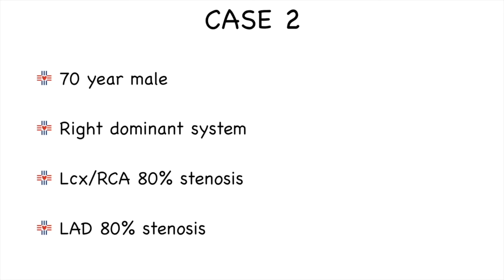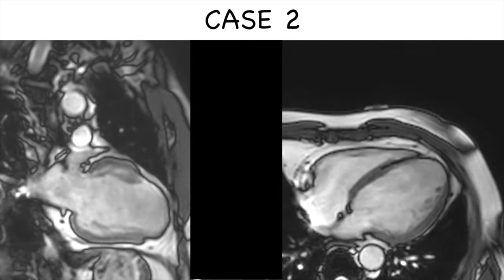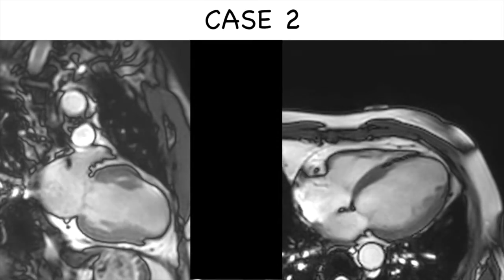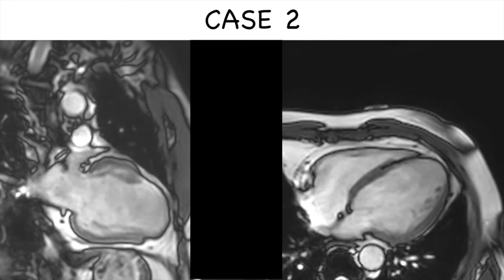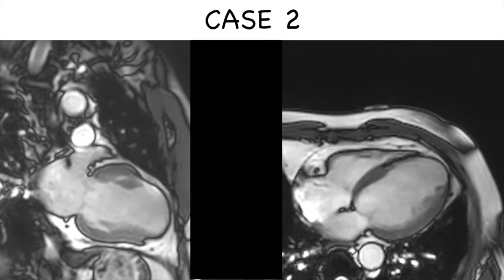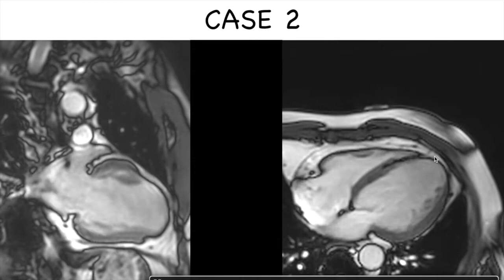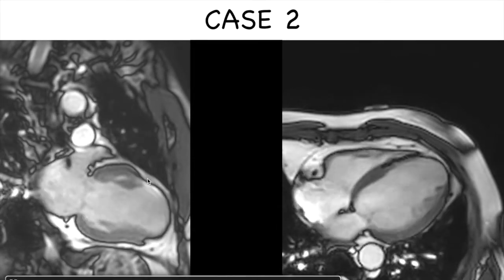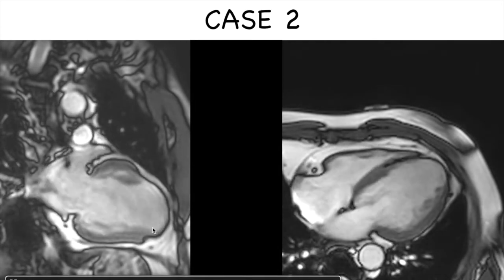Case number two: a 70-year-old man with a right dominant system. All three vessels have disease with up to 80% stenosis, and the question is to assess viability. On two-chamber and four-chamber cine views, the right ventricle is functioning well with very minimal mitral regurgitation. What is obvious is that the apex is akinetic and thinned out. The apical anterior segment is also thinned and akinetic. However, the inferior segments seem to be working very well.